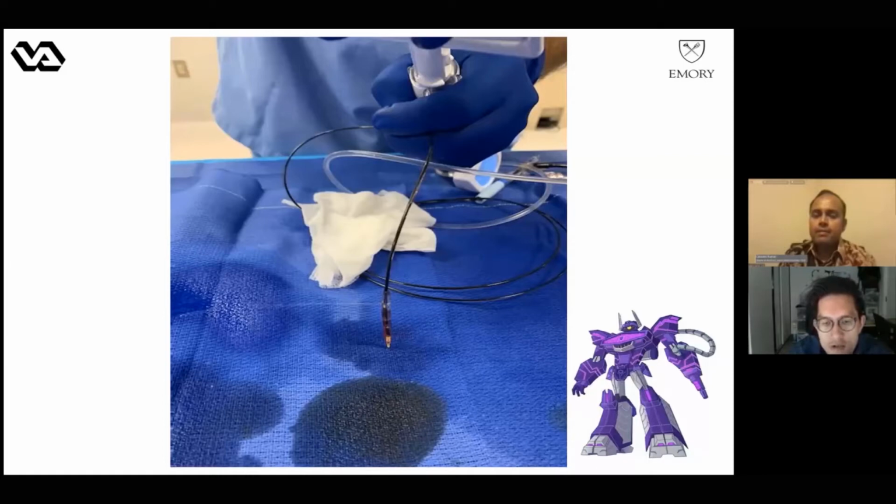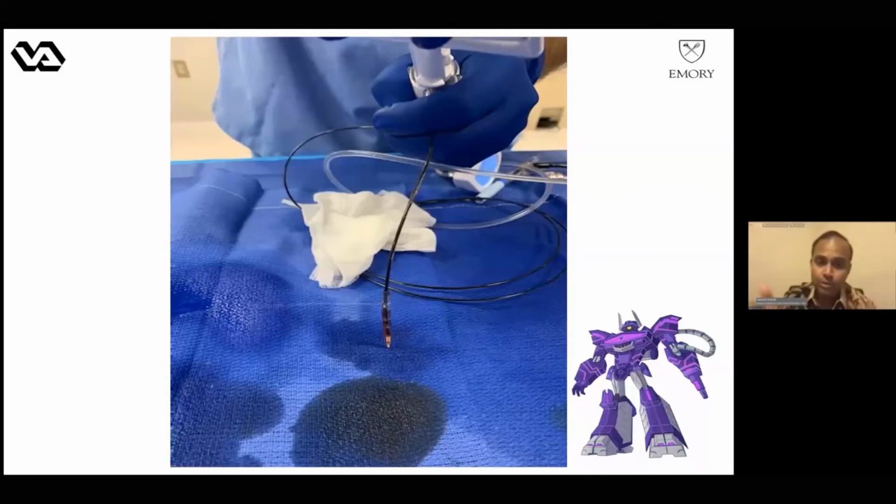But then I have a short question. When you see the rupture or the extension of the hematoma, do you think it's due to the shock wave that was given, or due to the hydraulic pressure when you rupture the balloon? What do you think? Perfect. We'll talk about it in a second. There are a number of different mechanisms for this. There are a couple of different possibilities. Yes, it can be due to the hydraulic jet. As you can see, you have a nice little hydraulic jet here. Our balloon rupture happened at 2 atmospheres. We never made it to 3 atmospheres.